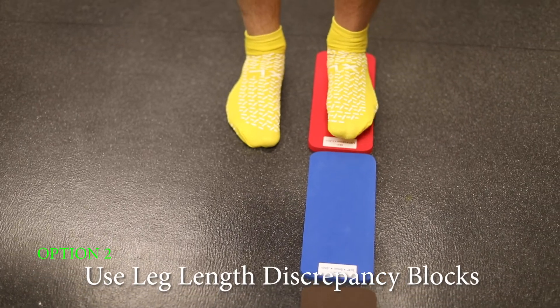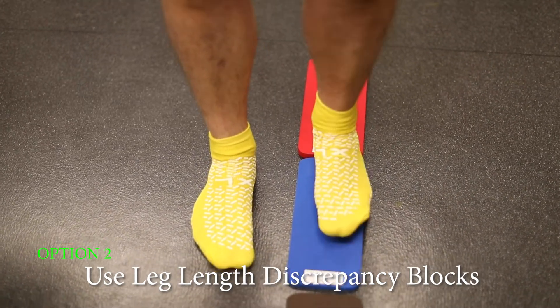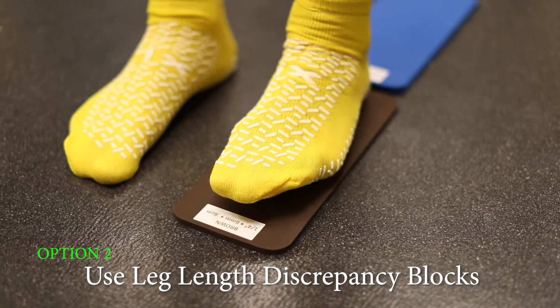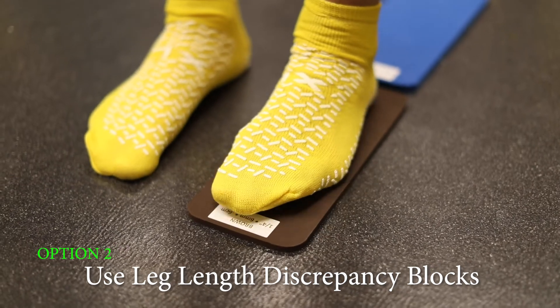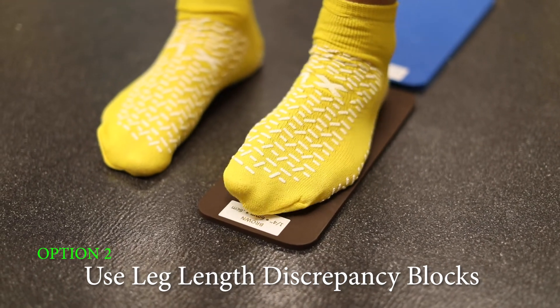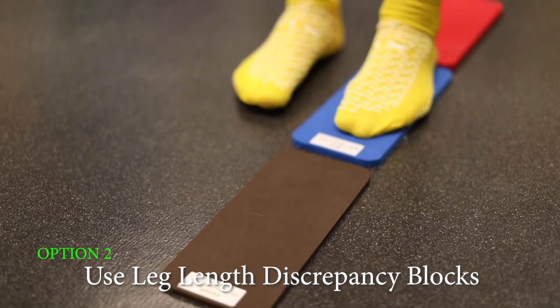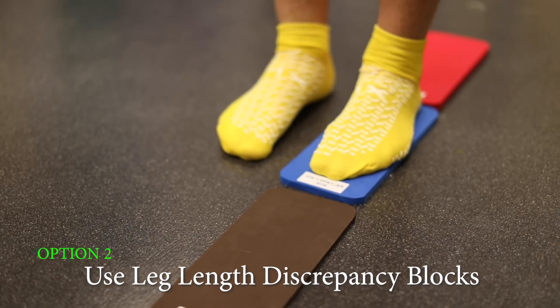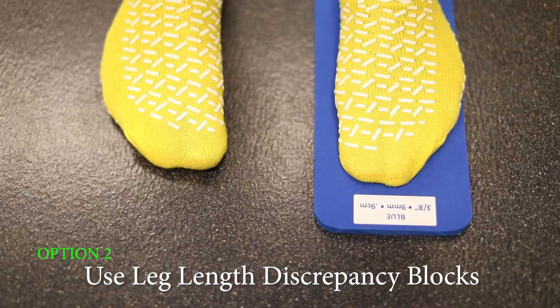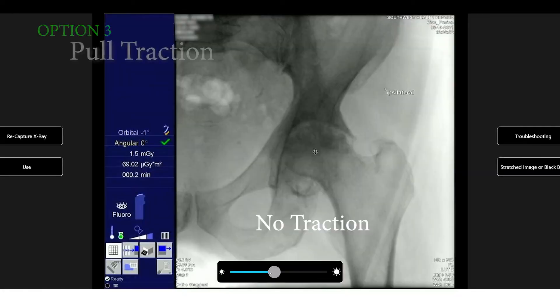The second method uses a Coleman block type technique where, pre-surgically, I had the patient stand on a measured block to obtain his preconceived leg length discrepancy. With this patient standing on blocks pre-surgery, he felt that he was between 8 and 9 millimeters short on his arthritic side.